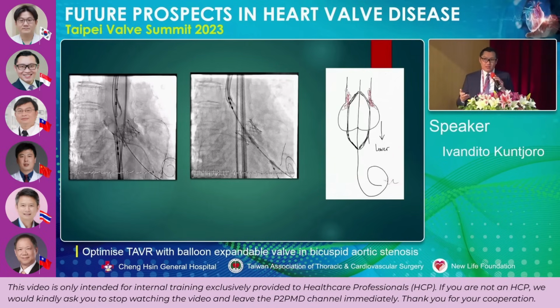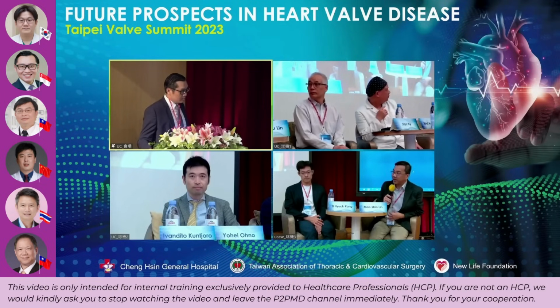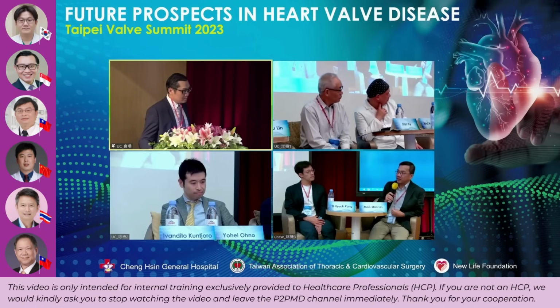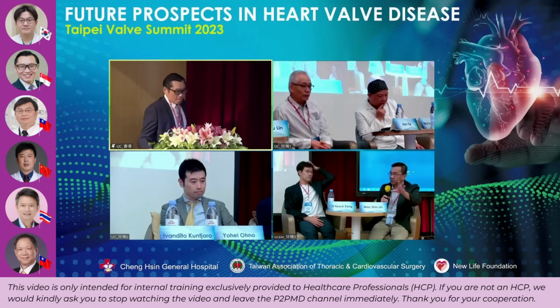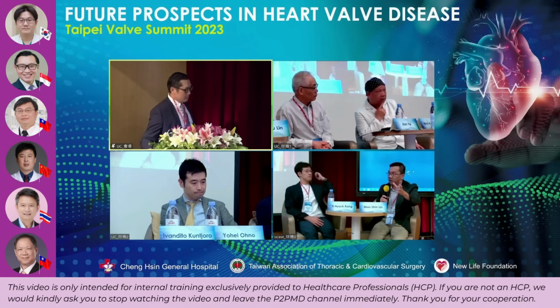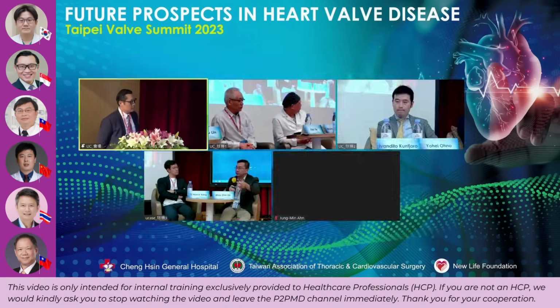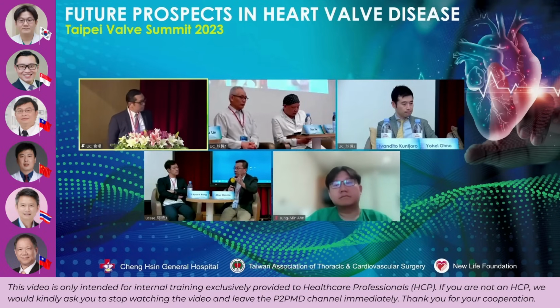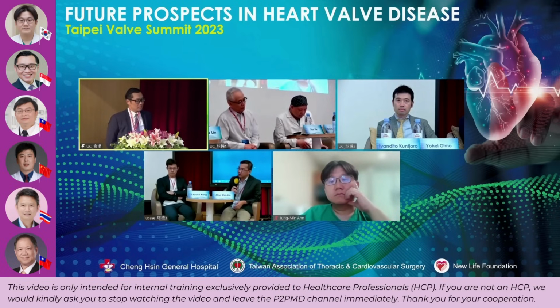The other thing is that by doing this, sometimes you want to flare the inner skirt of the valve a little bit bigger, especially if the patient has a balloon expandable valve. I personally prefer using the BEV more than the SEV for the bicuspid valve, because the bicuspid valve is prone to have a horizontal aorta and heavy calcification, so the balloon expandable valve has more resistance to the calcification, and also a large annulus. You can see in the demonstration that with a large annulus there is a lot of unpredictable movement during the deployment. So I agree more with that.